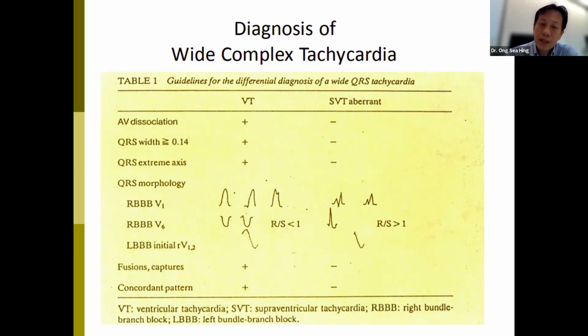Obviously, if the ventricular focus in the ventricular tachycardia is coming, for example, from the left ventricular apex, then the electricity will be moving up the ventricle towards the right upper. So it will be towards the northwest direction, and that's what we call the extreme axis.